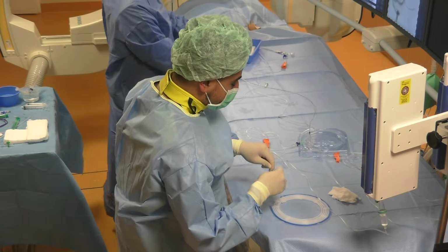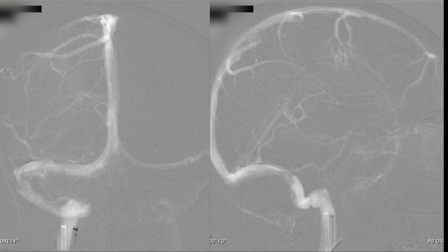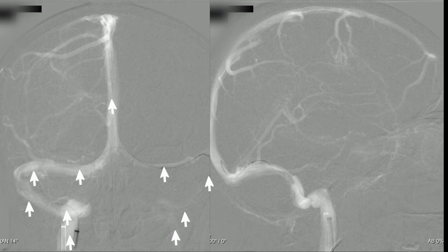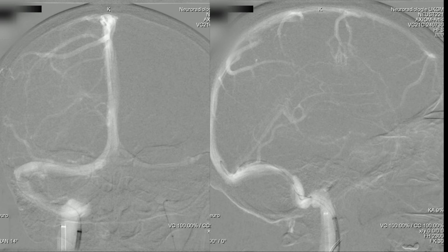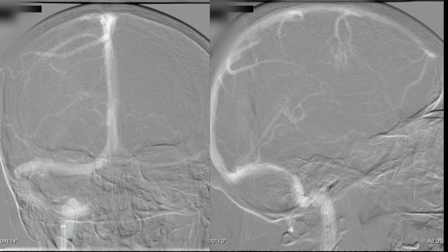Before we start the PTA and stenting, we need to measure the venous blood pressure to verify the hemodynamic relevance of the stenosis at many points, but the deciding measurement here is the transstenotic gradient. If we have a blood pressure difference equal to 7 or more, then it is a relevant stenosis, and we can perform the PTA and stenting.